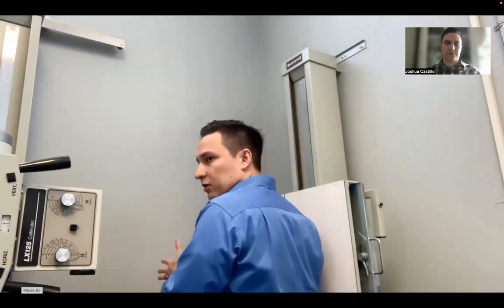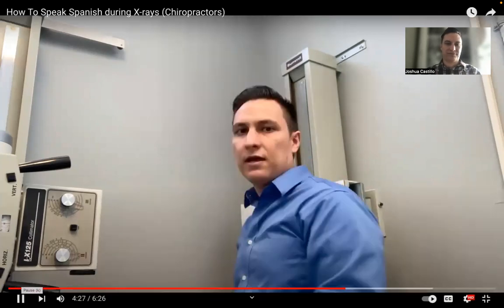And then if they're not close enough to this bucky right here, you have to say más cerca, por favor, más cerca, and then shift like this. You can show them how to shift. That's great because if you're doing an AP view and they're not where they're supposed to be, you can tell them to go atrás. But if their side is to the cassette and they're not quite touching, you have to say más cerca, more closer is basically what that means, so that you get a proper side view.